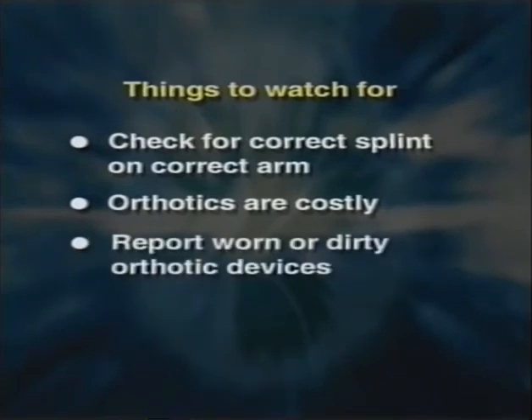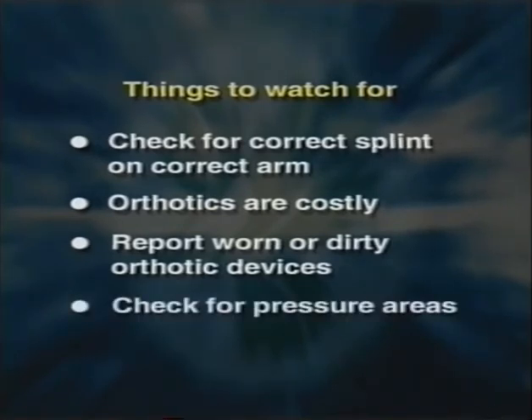Please report worn or dirty areas on orthotic devices to the appropriate therapists. And upon removal of the orthotic, check for reddened areas lasting more than 20 minutes. Remove the orthotic and bring it to the therapist. Common areas for pressure marks include bony prominences such as knees, ankles, and wrists. This concludes the orthotics section of this video.